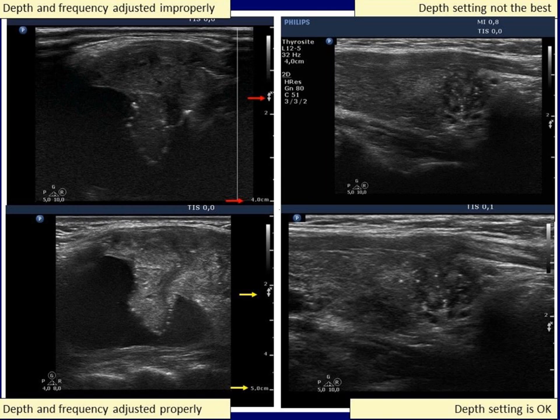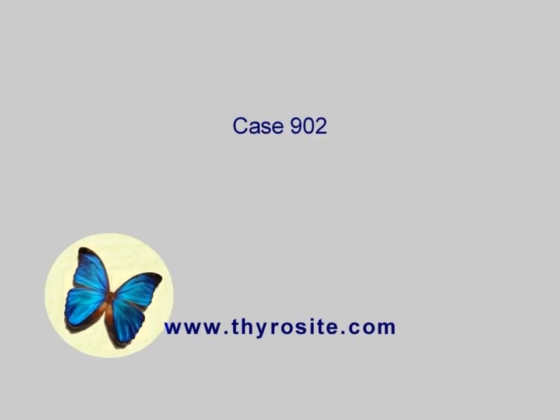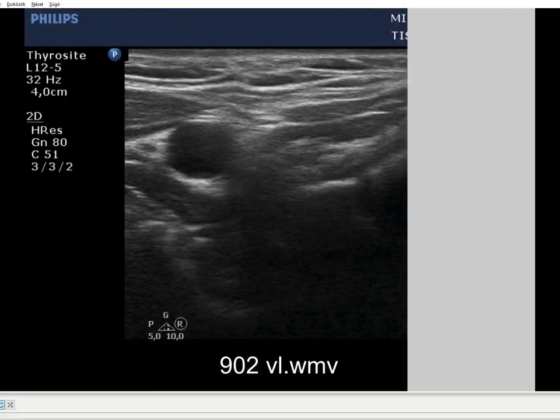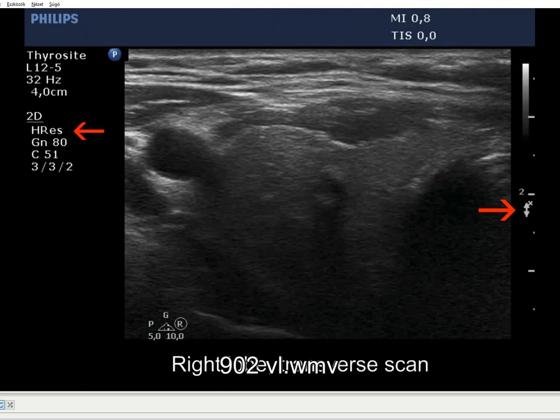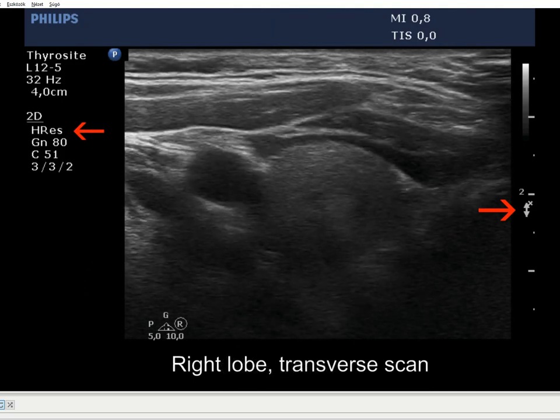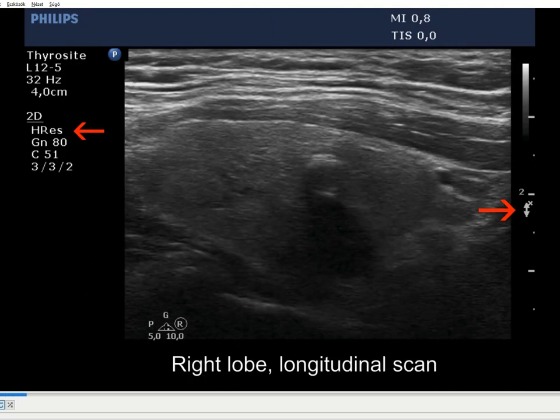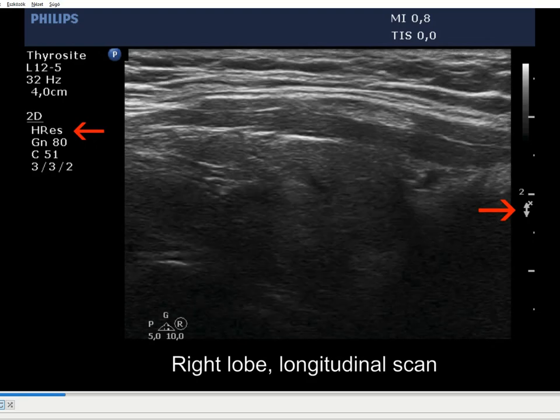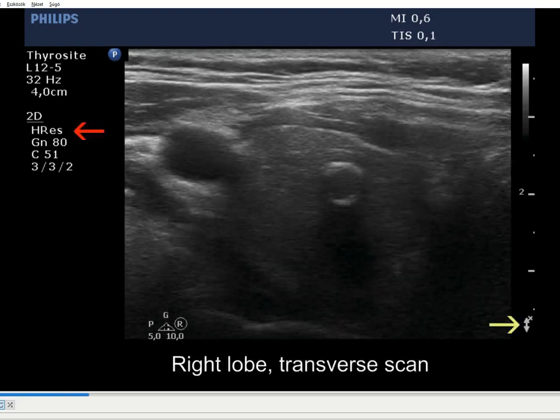Now I will present a video which demonstrates the importance of adequate settings. It is worth comparing the influence of the settings on the ultrasound presentation. First, we chose better resolution and the focus was set to 22 mm. The ventral half of the lobe, including the calcified focus, was more judgeable than the dorsal parts.